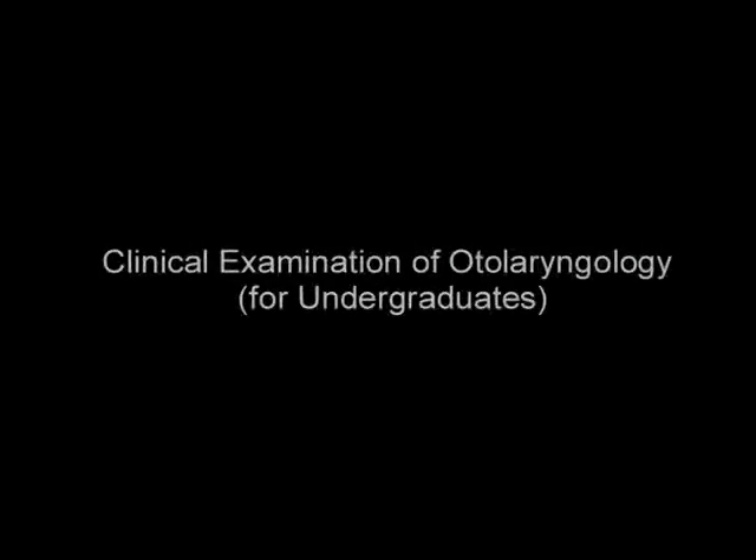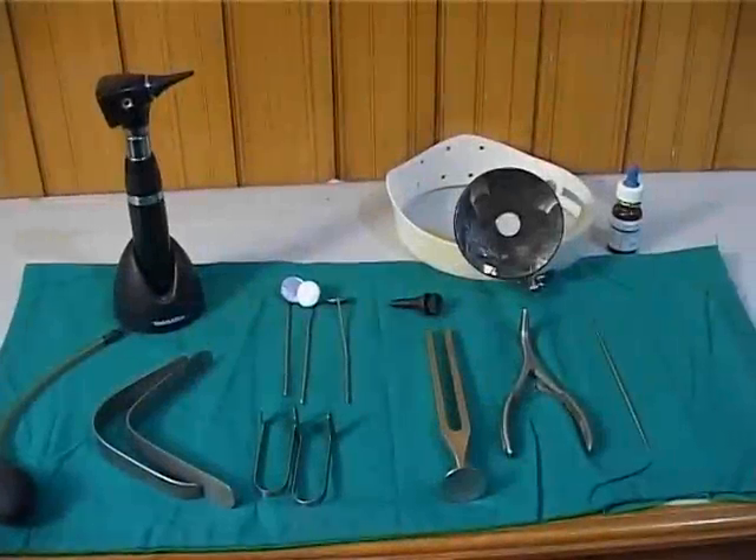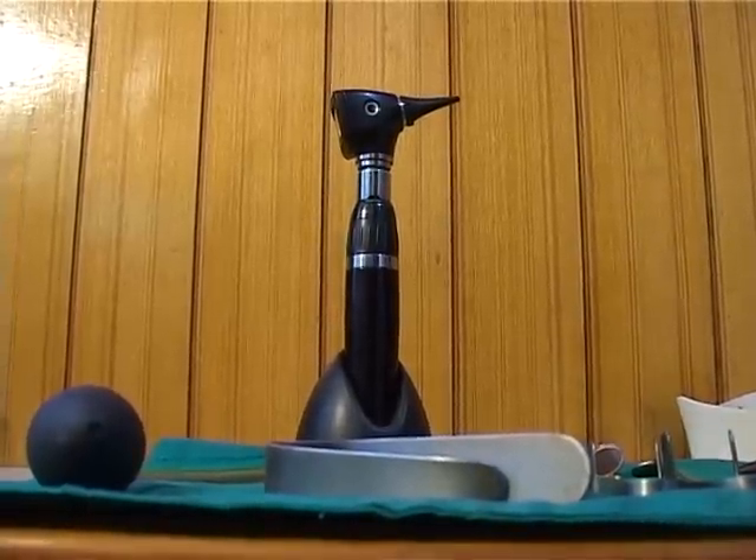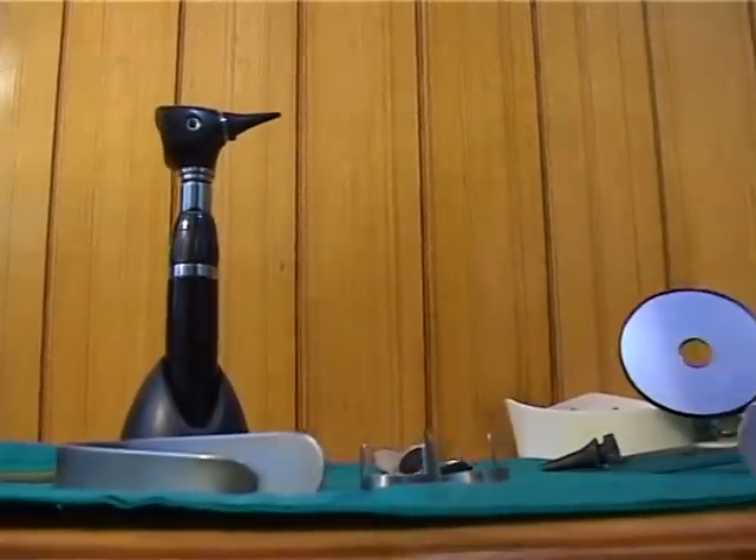This is a clinical examination of otolaryngology in a patient, designed to meet the requirements for undergraduate students. In order to examine the ear, nose and throat of the patient, one needs a good light source and specialized instruments.